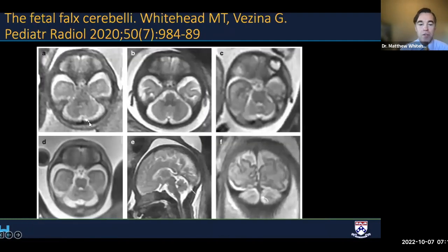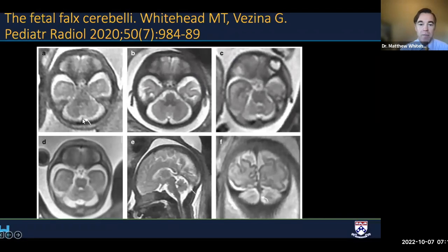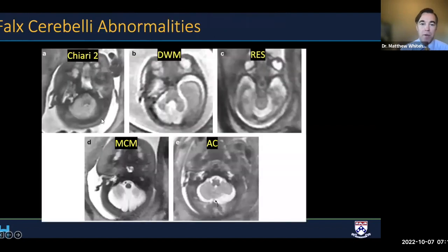The falx cerebelli is another important structure to evaluate, offering clues to posterior fossa pathology. It is normally seen in up to 98% of fetal MR studies, usually retrovermian centered, and more commonly Y-shaped, U-shaped, or V-shaped rather than linear. In Chiari 2, Dandy Walker malformation, and rhombencephalosynapsis it's usually absent. It's often multiplied in mega cisterna magna, and may be deviated in arachnoid cysts, helping you make that diagnosis.